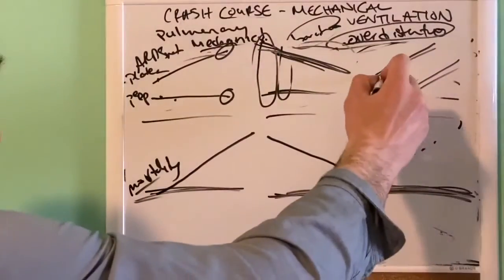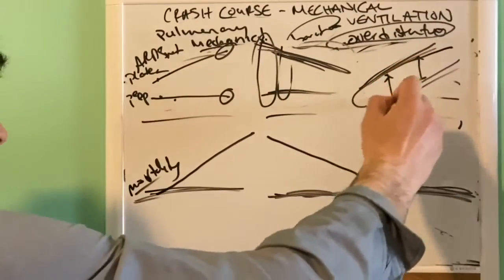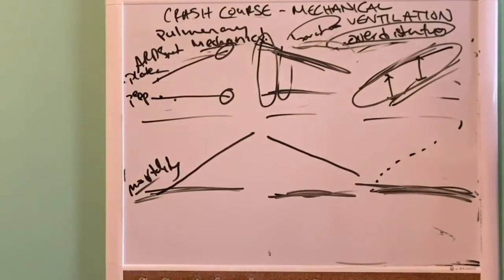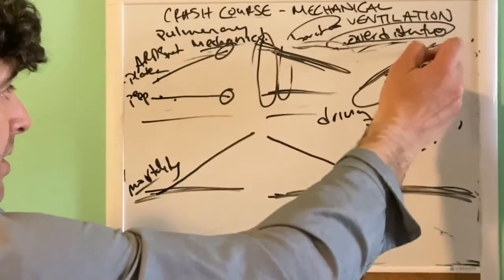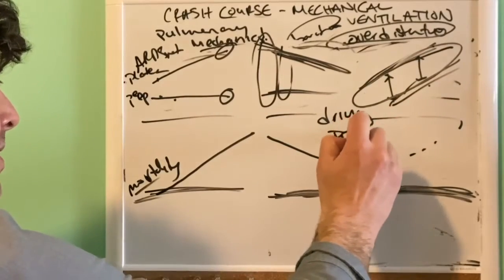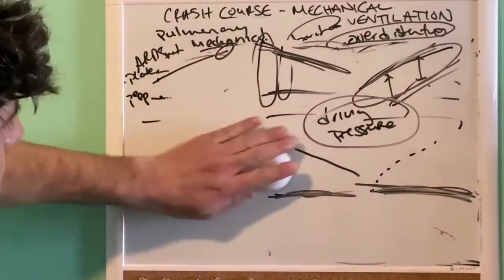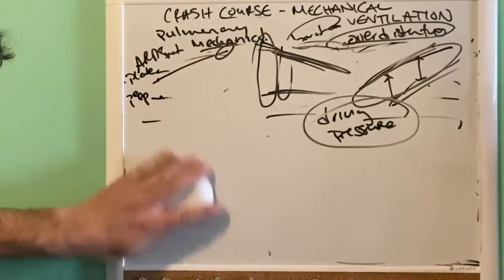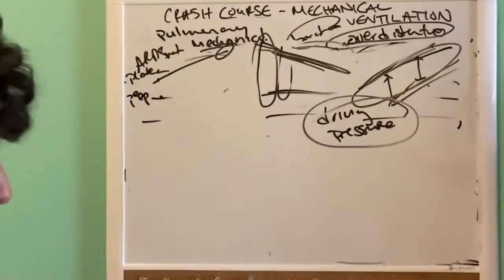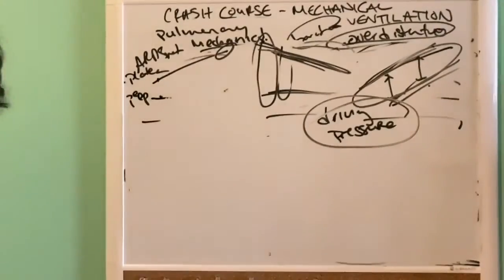And so really there's a big question now, this is the driving pressure, and the big question is: is the driving pressure really what we should be looking at, which is the plateau minus PEEP? And is this the real marker of one's mortality? So that's just something to think about, and why driving pressure is becoming an increasingly discussed notion, I think, in the last couple of years, and certainly when I was in fellowship.